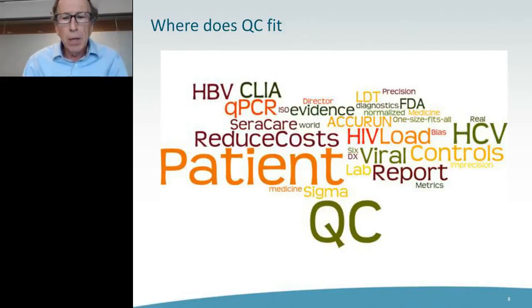Now let's think about it from the laboratory perspective. Laboratories are under a lot of pressure. You are CLIA certified, and you're running probably both laboratory developed tests and FDA approved tests. You're always under pressure to add more new assays, which is good because we want to be able to support patients and diagnostics as best we can. So you're under pressure to add assays, but at the same time, you're under pressure to reduce costs.